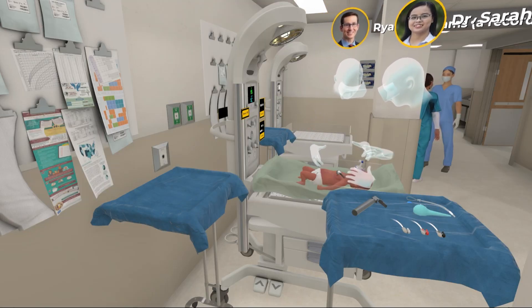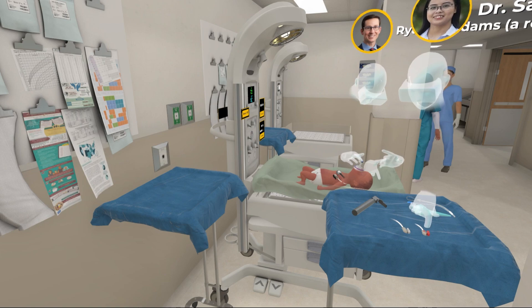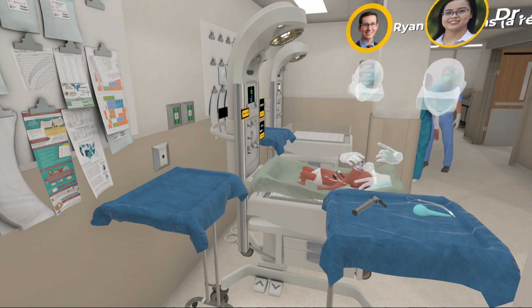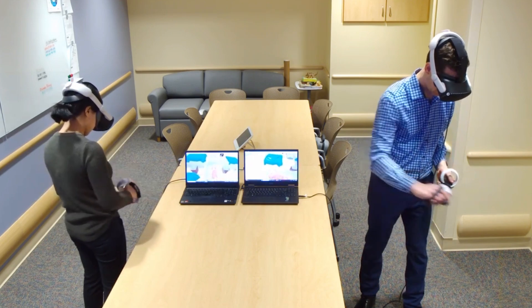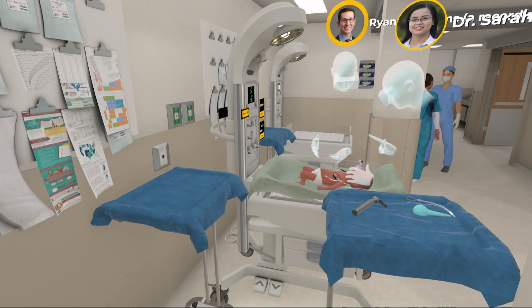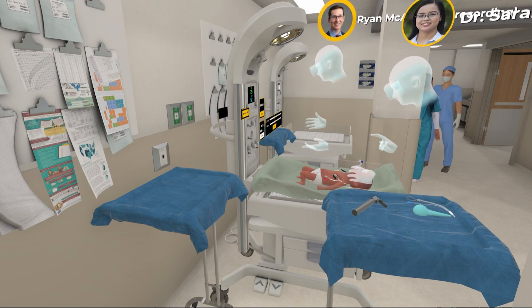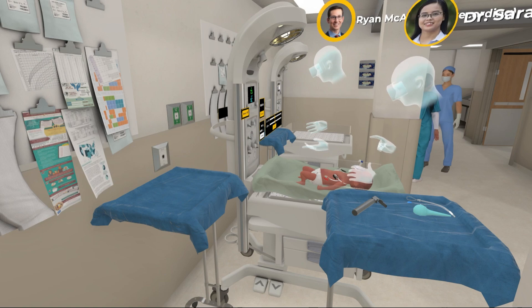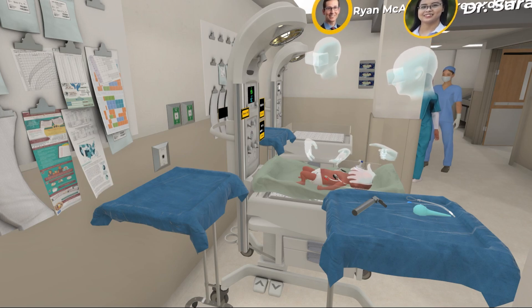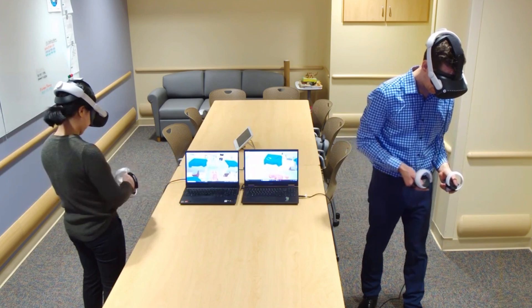You might hold PPV so I can place the EKG leads. I'm going to listen again. I'm still not seeing good chest movement. Unfortunately, our heart rate is still low and our sats are still low. I think we can go up on the PIP a little bit. Let's do 25. There's 25 — I went up on the PIP, and the PEEP's still 5. We're on 100% oxygen. Heart rate's still low, same with our sats, and I'm not seeing good chest rise yet.